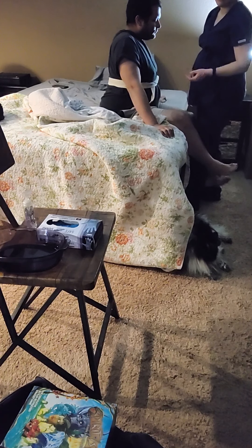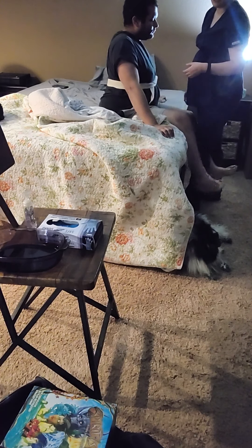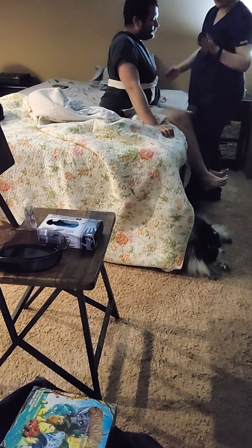Now for the purposes of this video, I do not have a walker for him to use. So I'm just going to stay with him, and I'm going to walk him around the front of the bed.